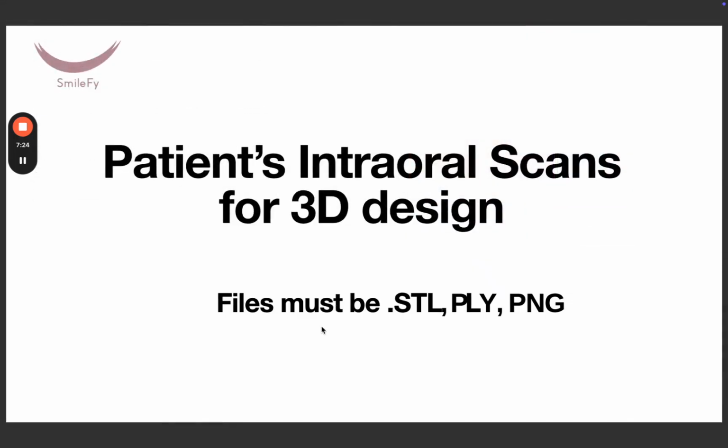Now let's talk about patients' intraoral scans for 3D design. In terms of files needed for intraoral scan, you can use STL format, PLY, or OBJ. For picture protocol, you will need a PNG format or a JPEG format.